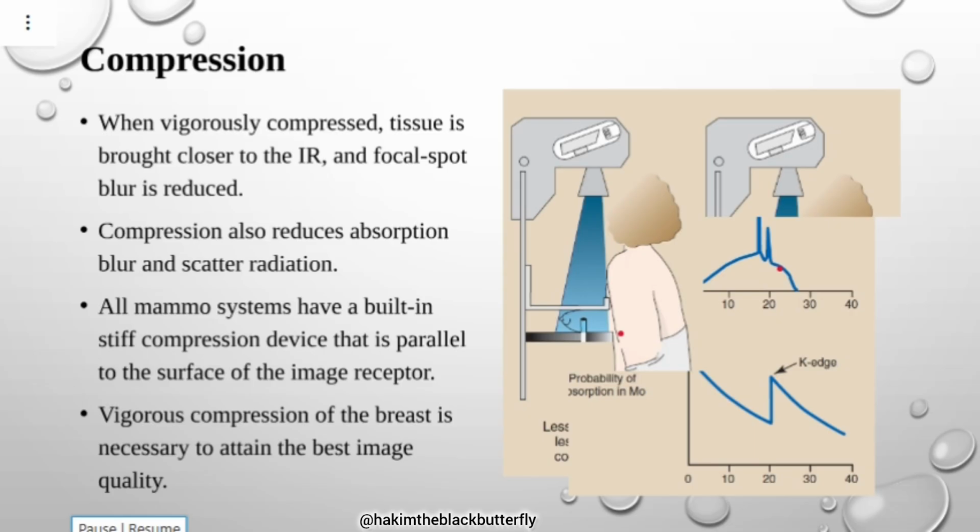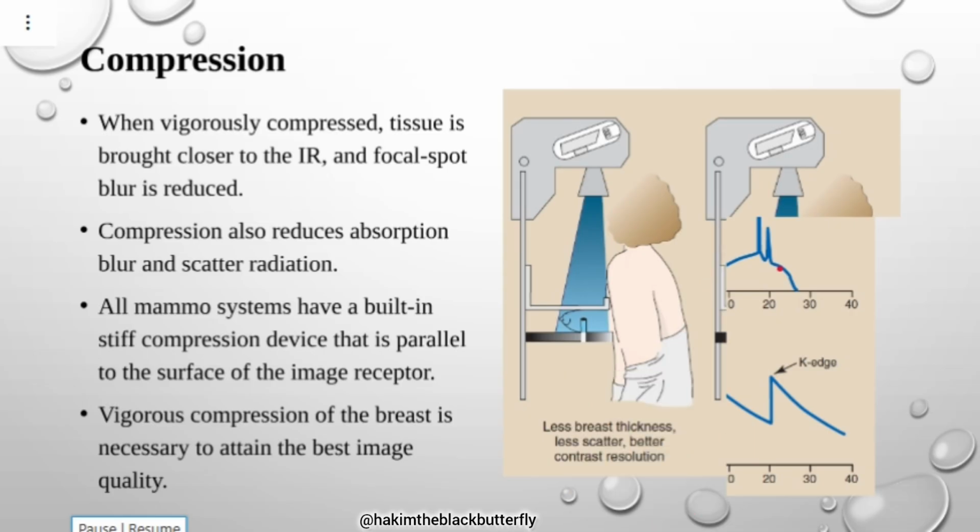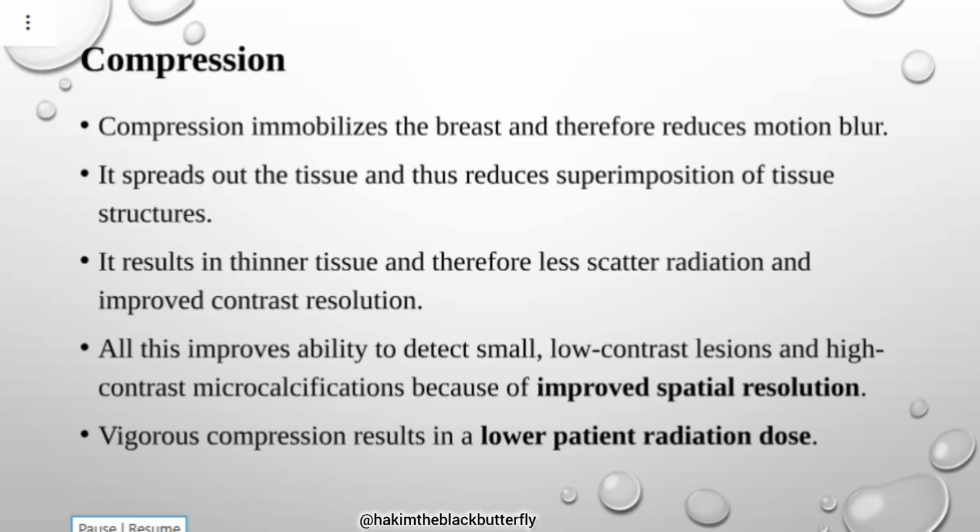To attain the best image quality possible. Compression immobilizes the breast and therefore reduces motion blur. This is another advantage. It has about five advantages, and you need to know them because I asked them. Compression immobilizes the breast and therefore reduces motion blur, because mammography is performed when the patient is standing.